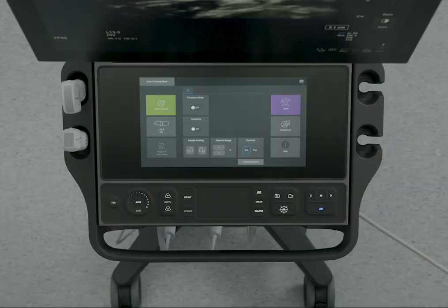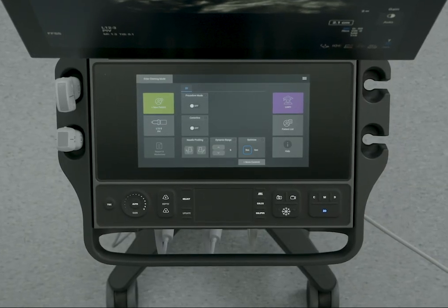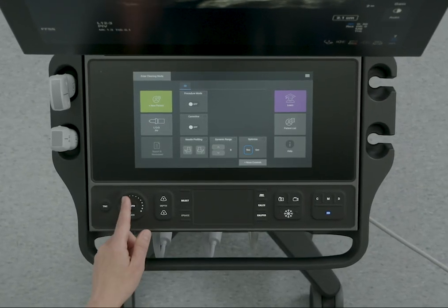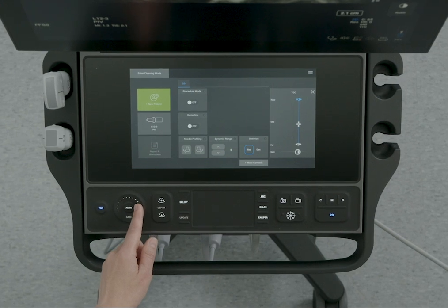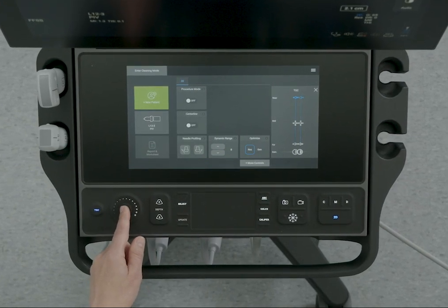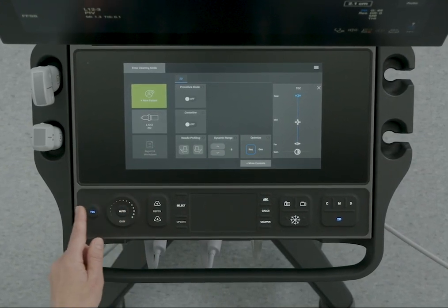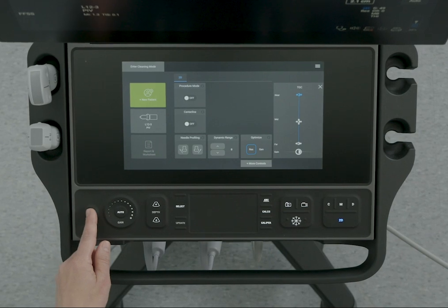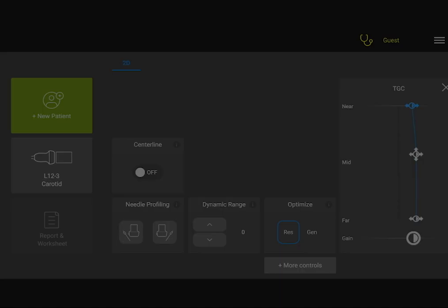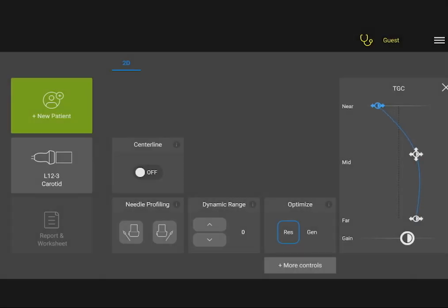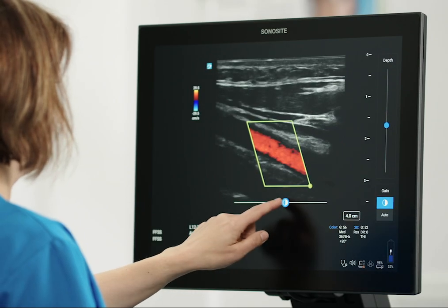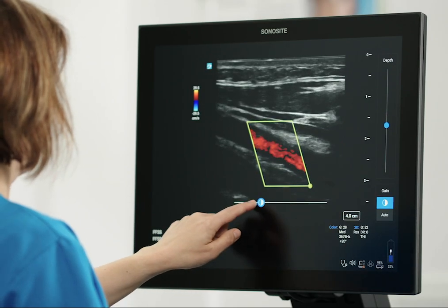You can adjust the gain on your system in several ways. Use the Gain Wheel. Use Auto Gain to automatically adjust the image. Use the TGC control and the Touch Panel to adjust the on-screen gain controls for fine control of the gain profile. Or adjust the gain directly on the clinical monitor.